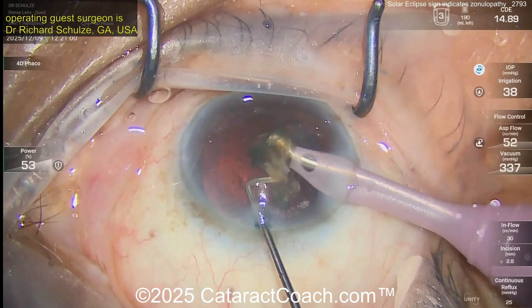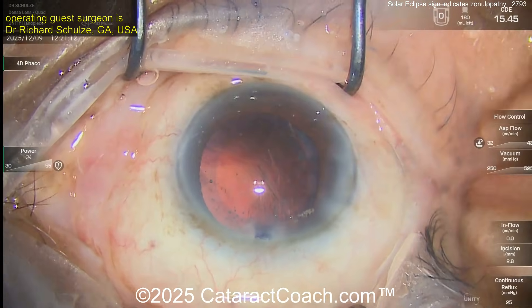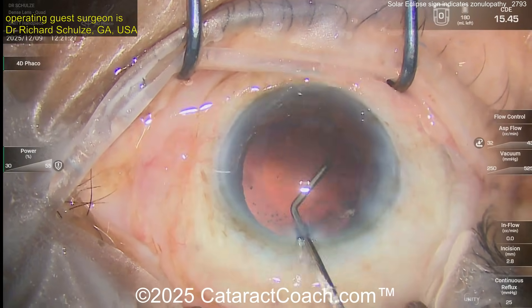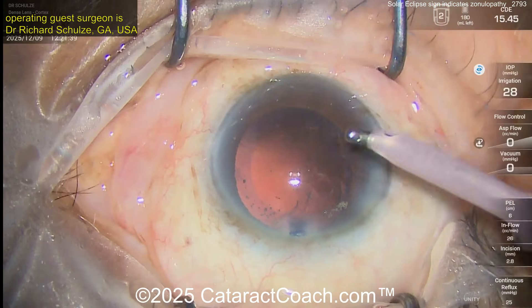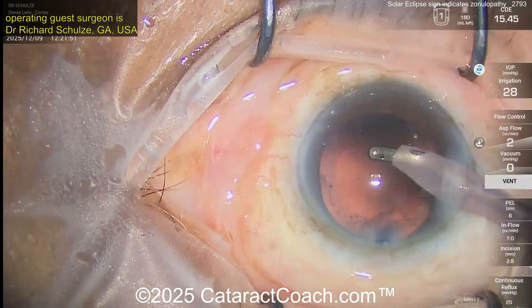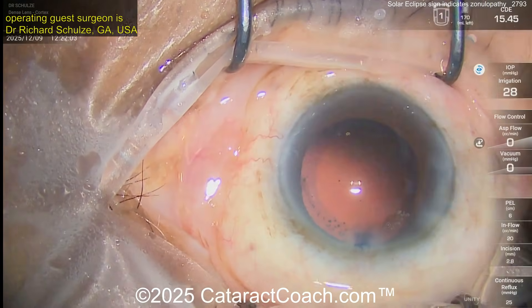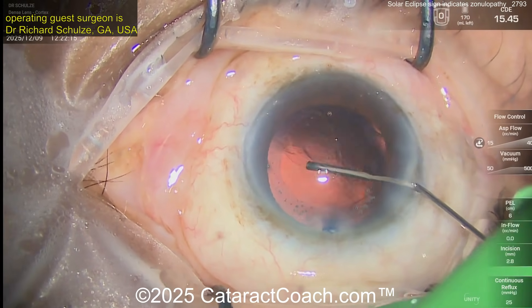Because the CTR is in place, you won't have a floppy bag. The danger without the CTR — with that weak bag from the zonulopathy — is that you could get a lot of that floppy bag coming up towards the phaco tip. Now removing cortex, and that looks pretty clean. Overall it looks like pretty good support; I don't think you need to do anything else other than that CTR. If it is traumatic, hopefully the patient won't sustain any further trauma.